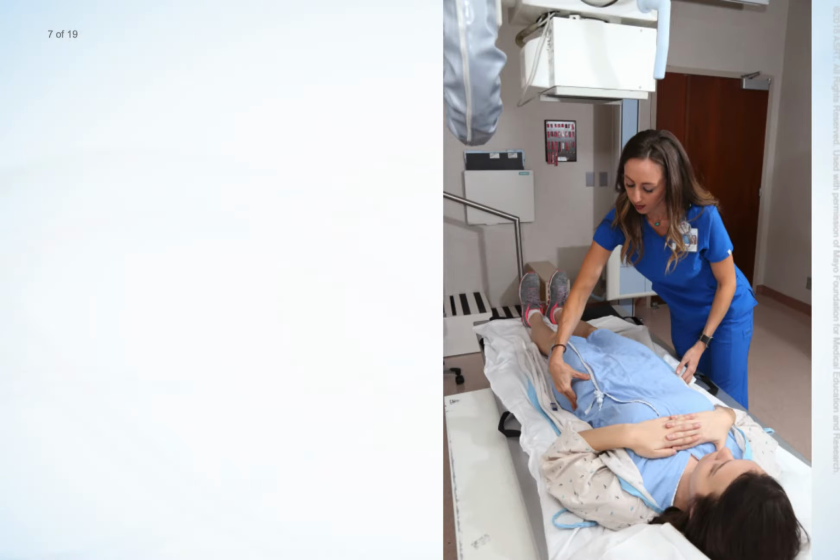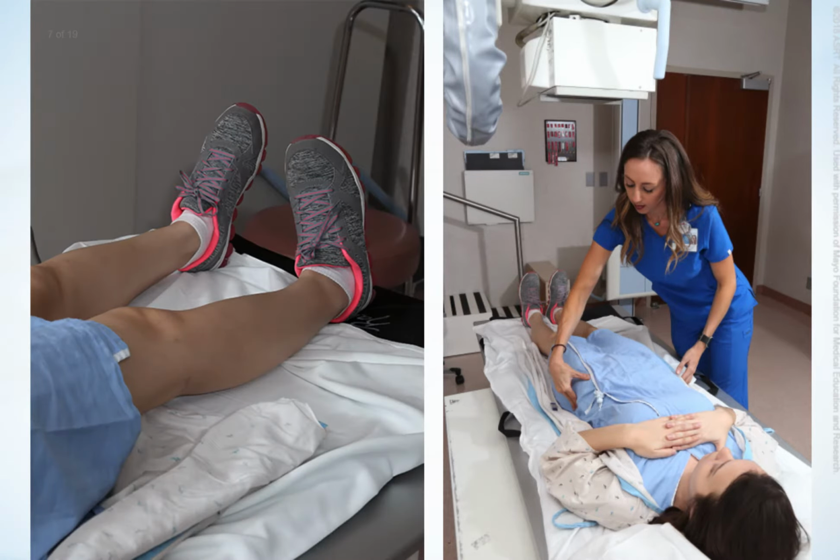Unless contraindicated, the patient rotates the affected leg and foot approximately 15 to 20 degrees medially to position the femoral neck parallel with the plane of the image receptor. If needed, place a cushion under the knee and a sandbag over the ankle to help the patient maintain the correct position.